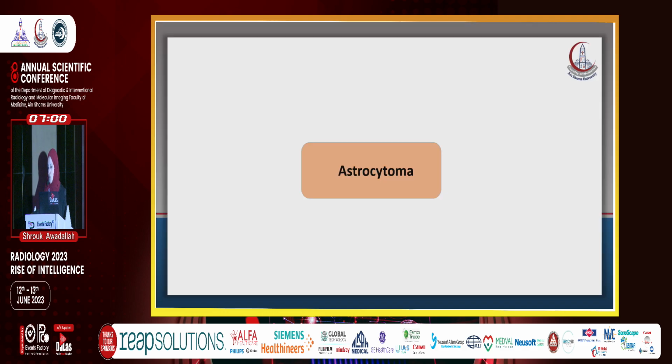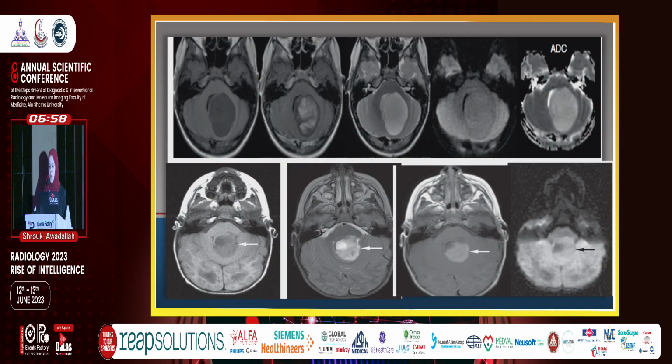The fourth choice was astrocytoma. Also, astrocytoma occurs in a cystic or solid nature, and both tend to have facilitated diffusion.